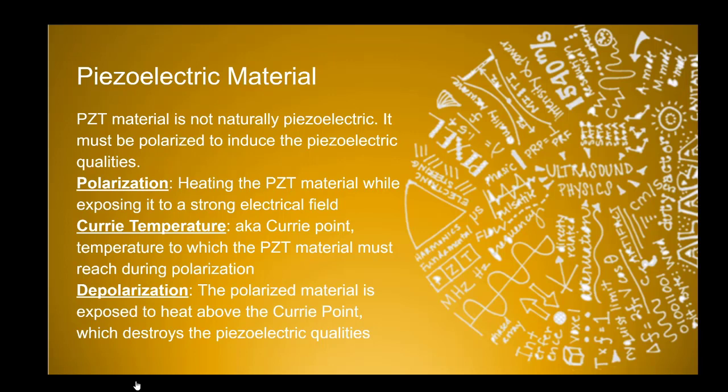So again, when man-made PZT materials are made, they take the lead zirconate titanate material, they're going to heat it up to the Curie temperature while it's in an electrical field. That now creates our PZT materials as we know them so we can use them for ultrasound.